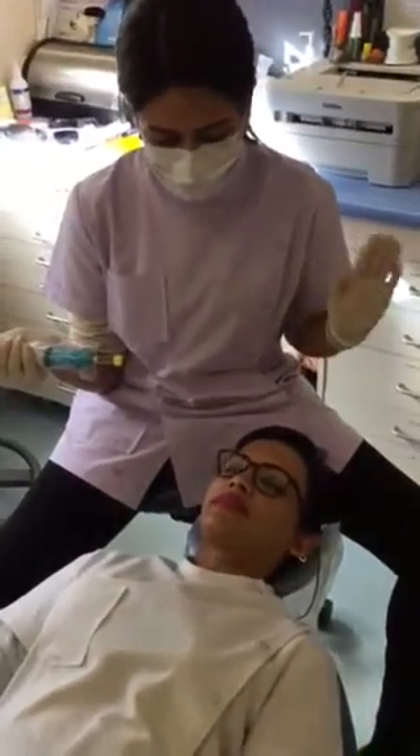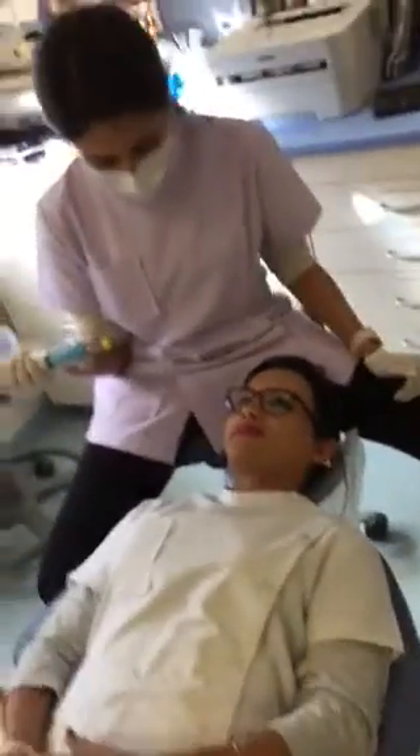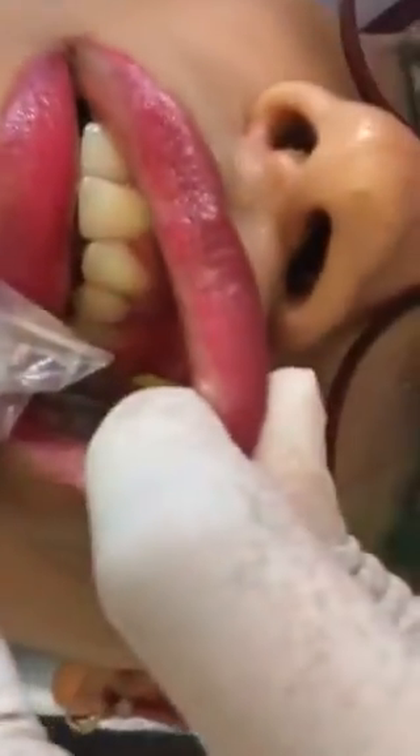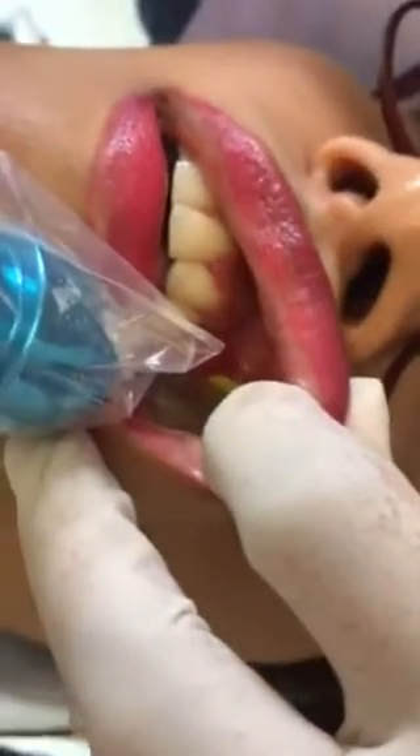Me and Dr. Chitra are performing an infiltration. Hi ladies, okay go for it. So you're performing on tooth number two five. Just apply a bit of pressure. Is that okay with your patient? Aim it a bit away — just like where you put your normal syringe, aim it a bit away, meaning exactly where you put your needle.